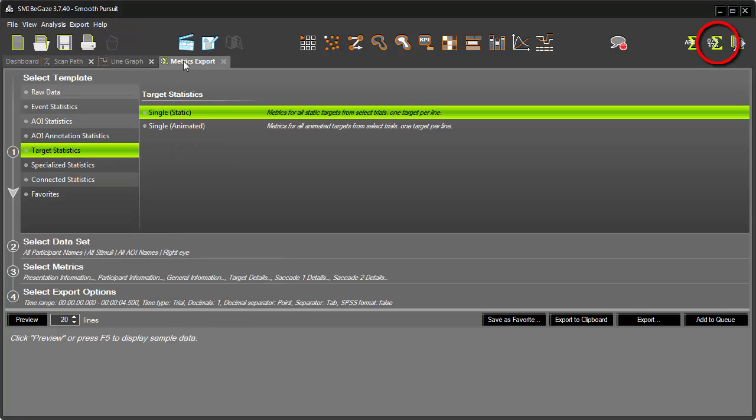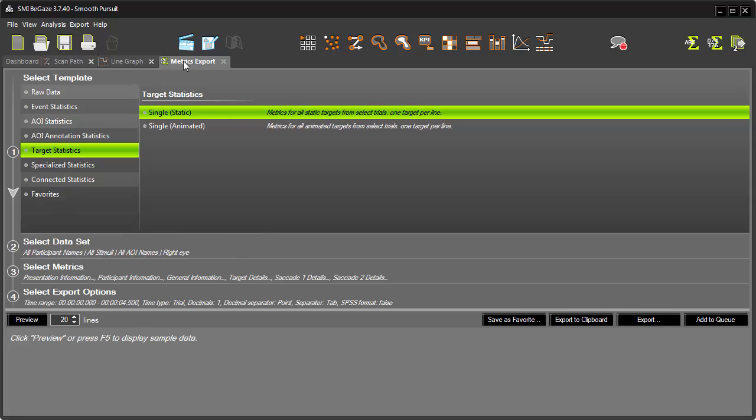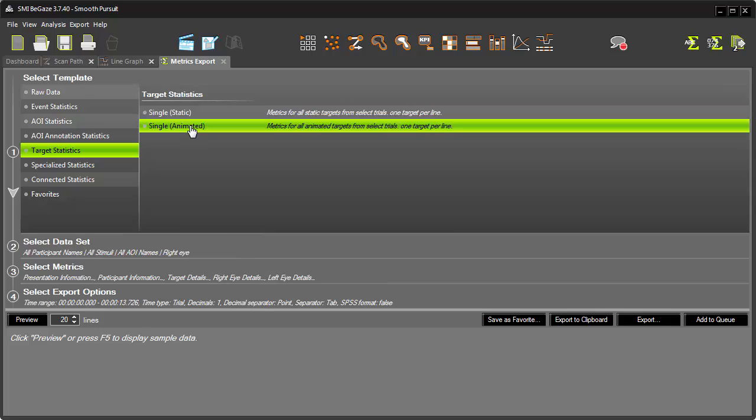For a quantitative analysis, we'll turn to Metrics Export. Metrics Export includes a target statistics template, ideal for analyzing saccadic and smooth pursuit experiments. You can choose either a static or animated template for a single participant, according to the type of target used for your experiment. In keeping with our smooth pursuit experiment, I'll select the Animated template.